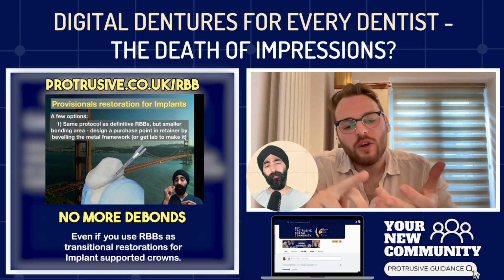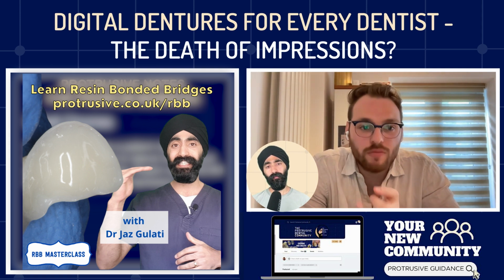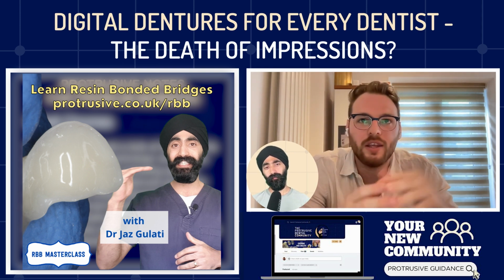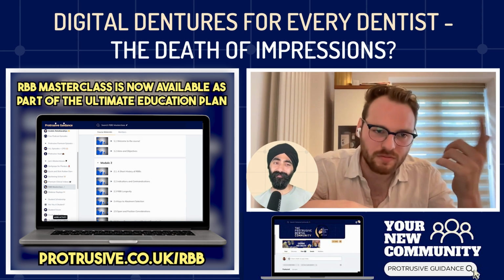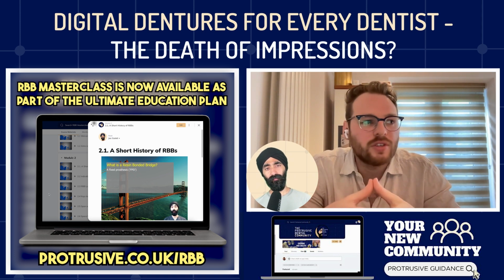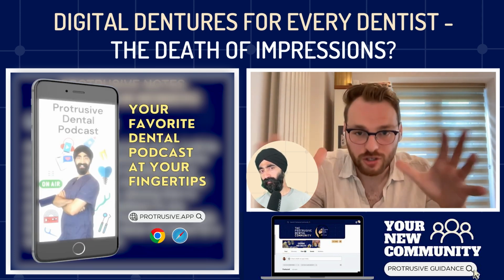So we'll do those scans. It then goes over to Chris, our chrome technician. He's going to look at path of insertions and guide planes and rest seats and undercuts, and he can say, ideally rest seats, how are these teeth for rest seats? We need to add, if we're going to use this as an undercut, etc. And then you can make all those adjustments, do all your preparations, and I would just scan again, try and get as much scan extensions as possible.